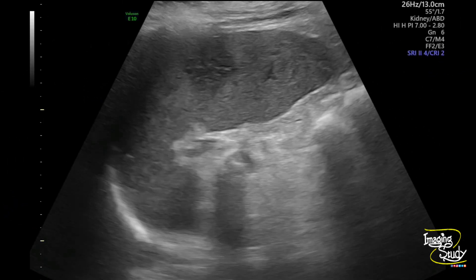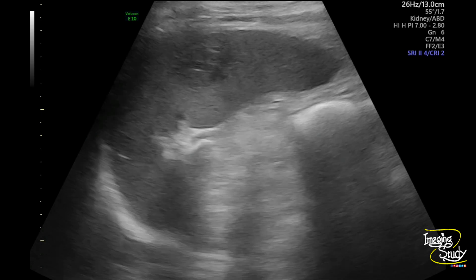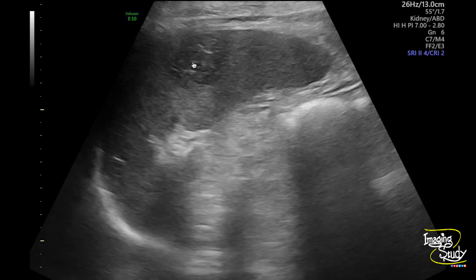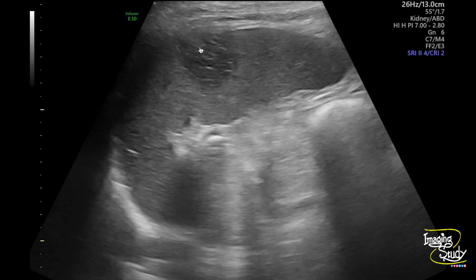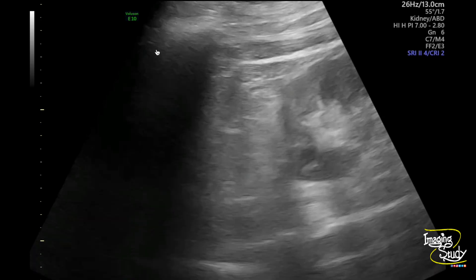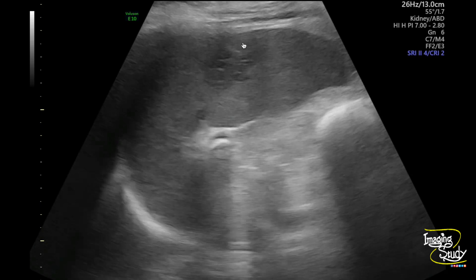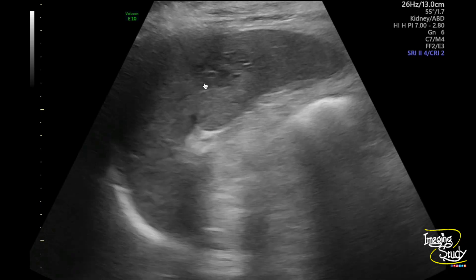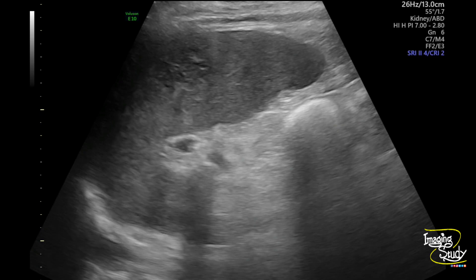Here's the spleen. You can see a hypoechoic area at the mid part near the splenic lateral margin. It took our concern, but with this resolution setup it may not be well understandable.